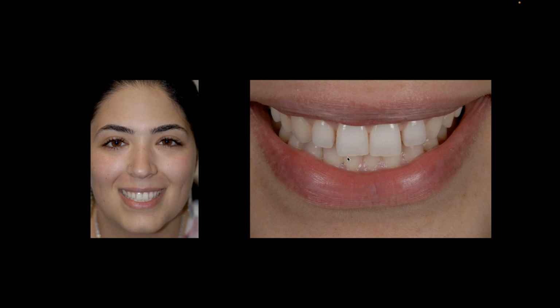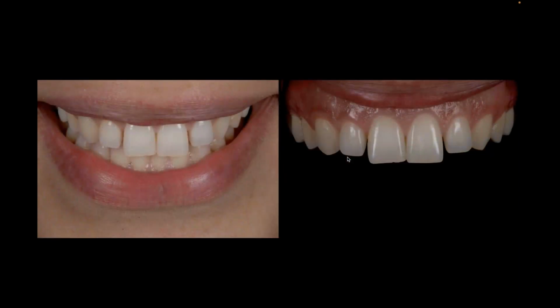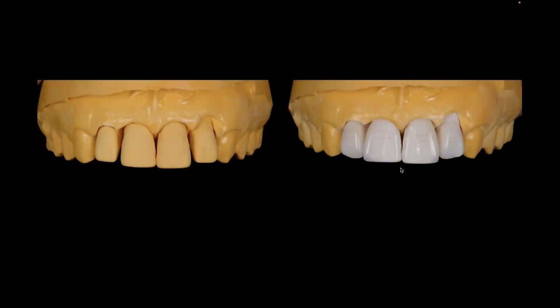So we don't want to prep those teeth. They're beautiful. She's not going to go back through ortho because she's getting married in a few months. So we did the most minimally invasive thing we could do. That was to do a little tiny enamelplasty on the 8 and 9. So just shave off a tiny, tiny bit of the incisal edge to straighten them out. I asked my doctor just to pack a little bit of cord around the marginal areas, and I'm going to treat these as window veneers.